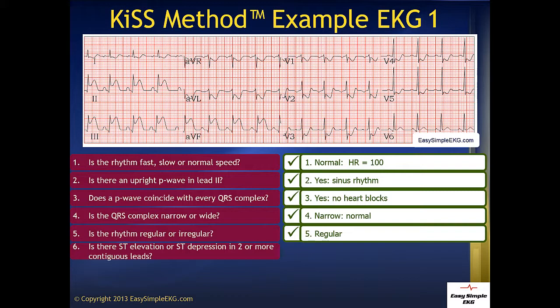Question 6: Is there ST elevation or ST depression in two or more contiguous leads? We begin in leads 2, 3, and AVF, because we always begin there. And we see ST elevation in these three contiguous leads. This means our patient has an acute inferior wall infarct.